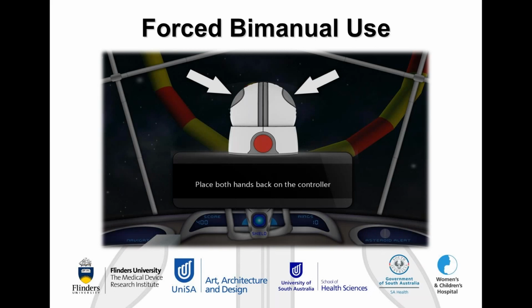So this is as annoying as someone sitting behind you with the remote control for the DVD player pushing pause at random intervals while you're trying to watch a movie. If their hands are not covering those smart sensors, the game pauses. But as soon as they cover the sensors again, they get counted back into the game, 3, 2, 1, and they can start playing the game again, and they haven't lost any ground as to where they were.